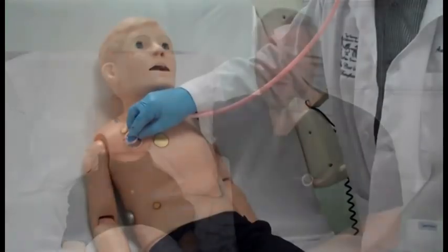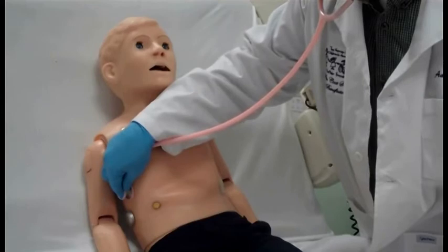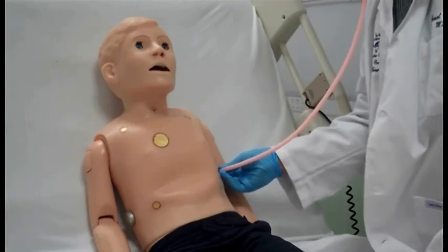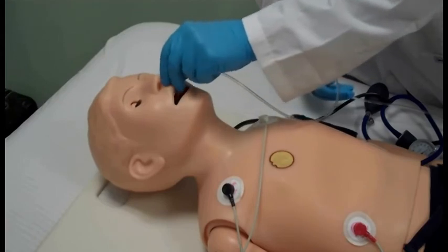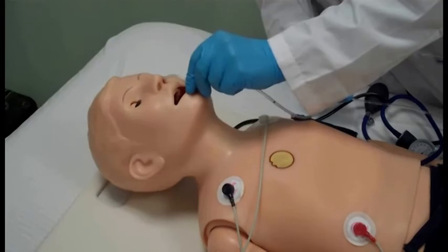I'm sure you will agree that Ralphie is an amazing piece of technology, but he does have a few limitations. While listening for lung and cardiac sounds, as with all of the mannequins, you will hear mechanical sounds from the pump. So please take time during your orientation to distinguish the mechanical sounds from the heart and lung sounds. Ralphie cannot stand or ambulate on his own, so he will need assistance if he's expected to move. Ralphie does not have a stomach, so please do not administer any oral medications or fluids. You will not get any return from a placed nasogastric or orogastric tube, also because he doesn't have a stomach.